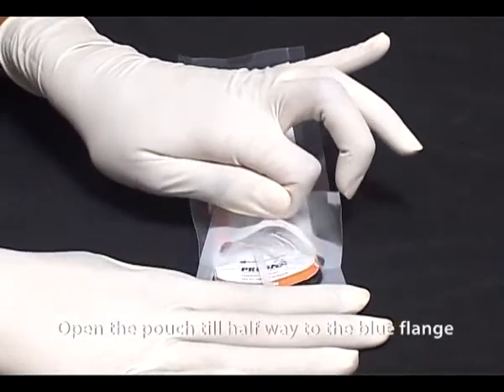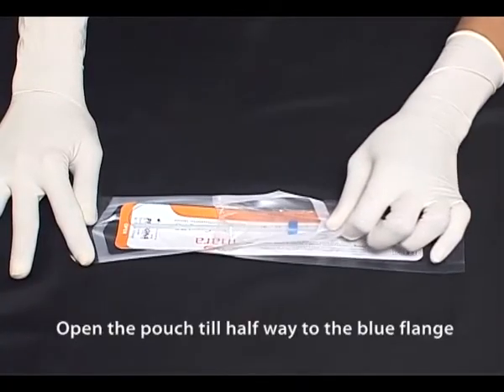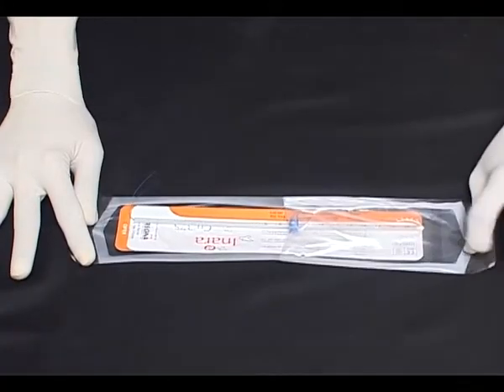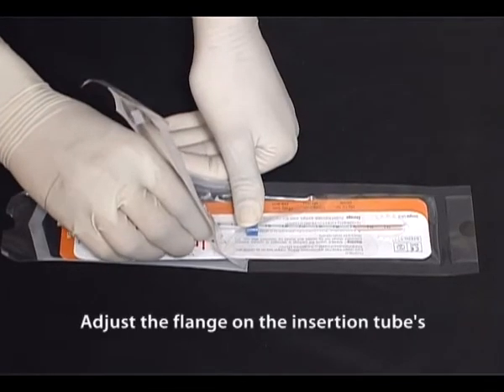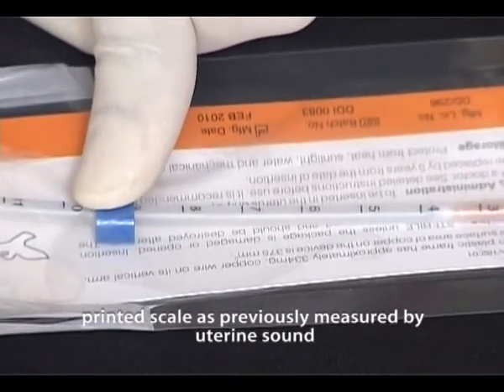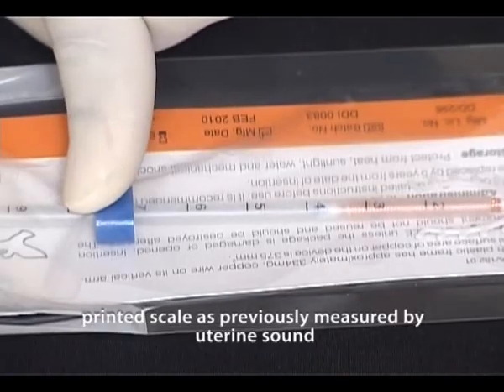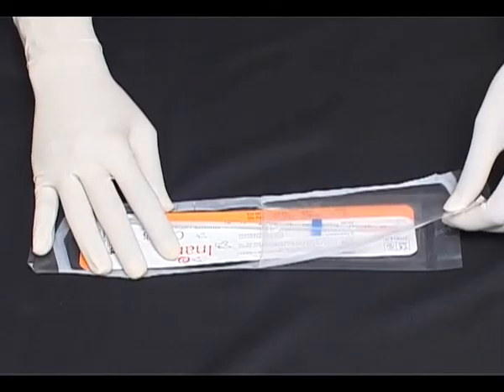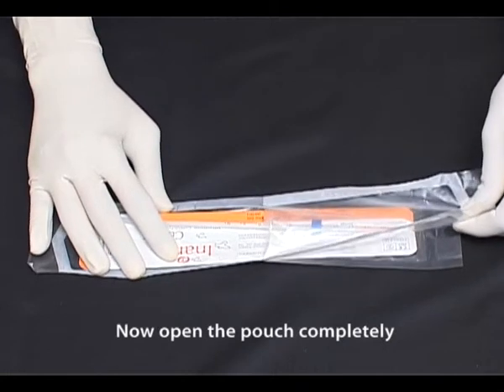Open the pouch till halfway to the blue flange. Adjust the flange on the insertion tube's printed scale as previously measured by the uterine sound. Now open the pouch completely.